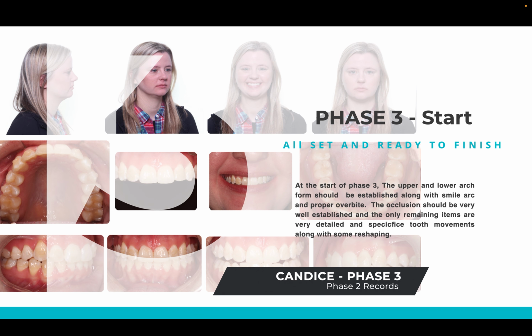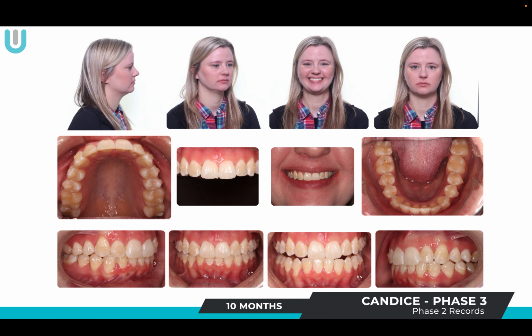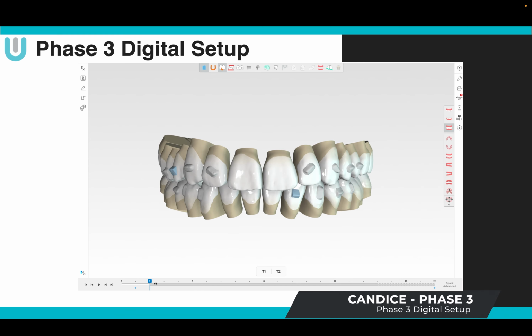And again, in our courses, we teach people how to do this. One, two, three, finished. And we do account for one additional 3+, but that's at a cost. So here we are at 10 months. We're very close. Now, what am I expecting?